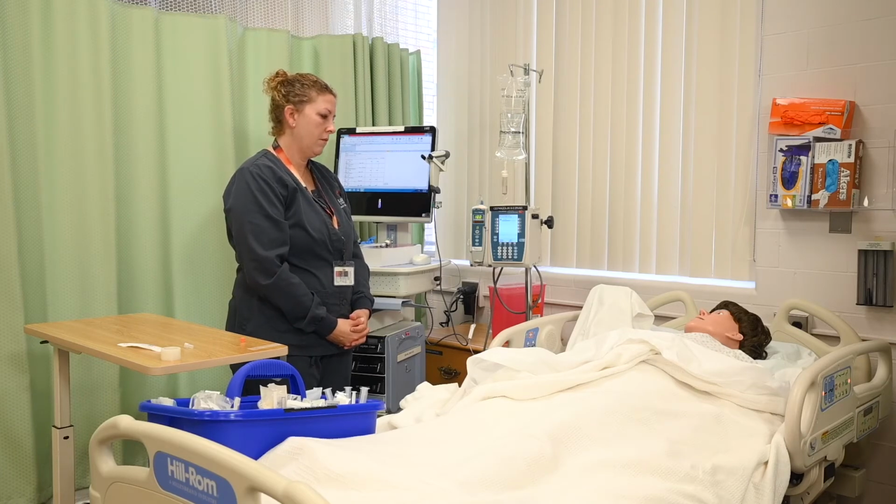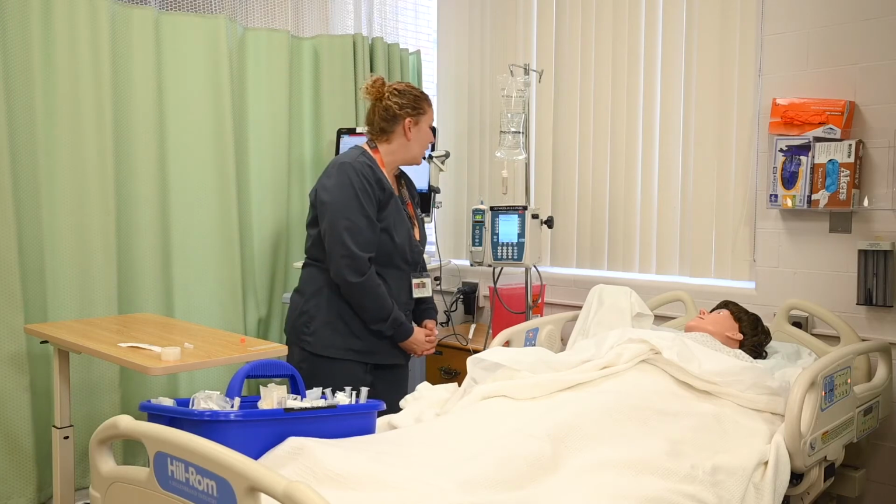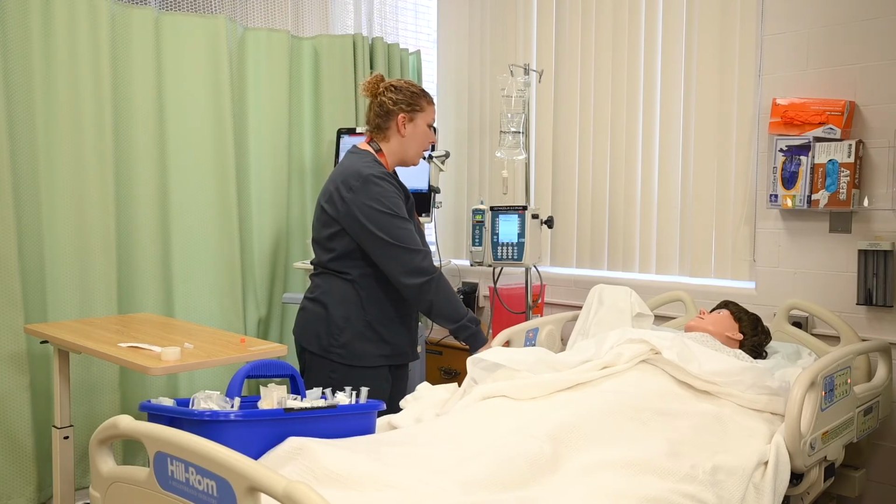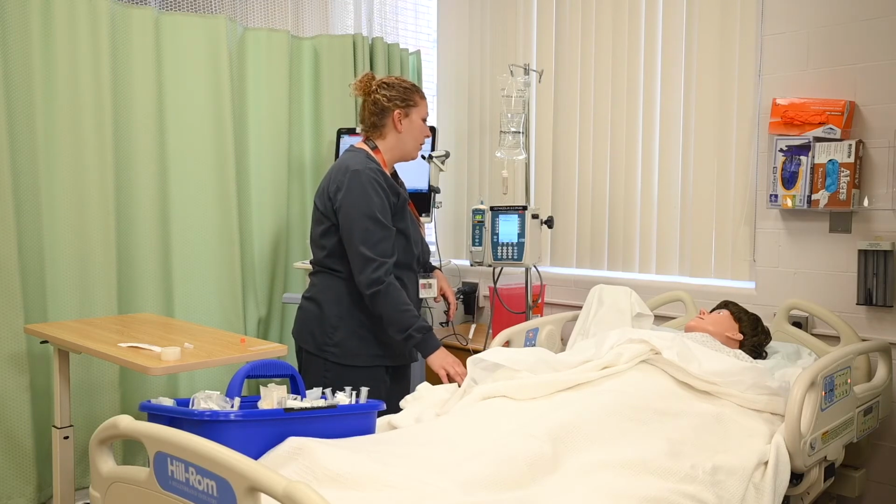Instruct the patient on how to move or turn without dislodging the IV catheter. So IV, as I've already told you, now that you have the IV catheter in and the IV tubing connected with the IV infusing, you'll just want to be careful when you move your right arm to make sure that you don't snag the tubing or snag the IV.